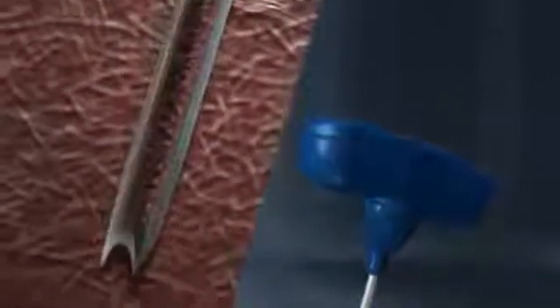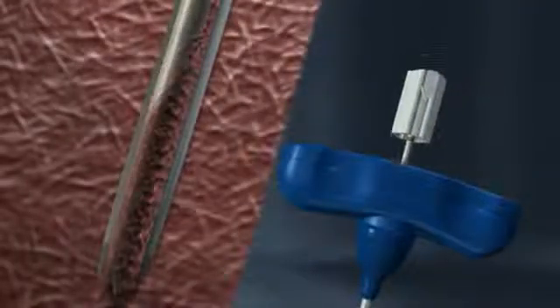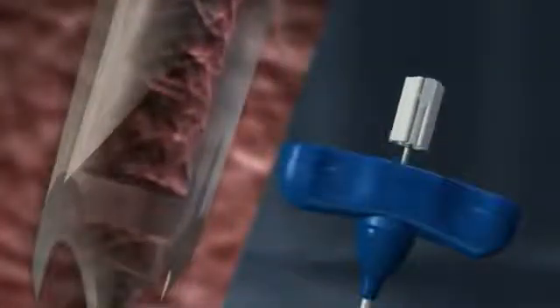If an additional specimen is desired, the procedure can be repeated using the same cortical passage and the same cannula. That's right, there's no need to introduce another bone marrow biopsy needle in order to obtain additional samples. Simply advance the biopsy needle farther into the medullary cavity, insert the marrow acquisition cradle, rotate, and withdraw.